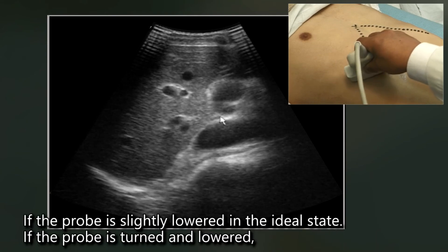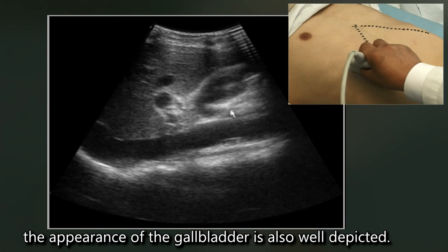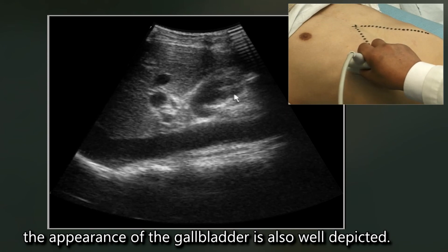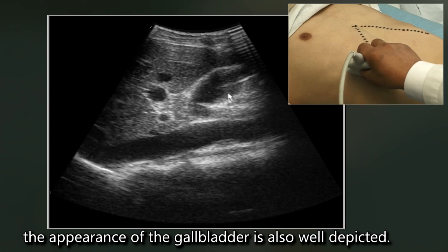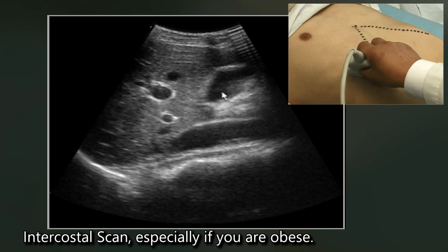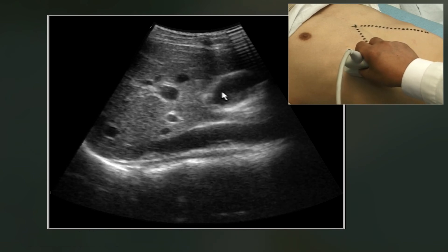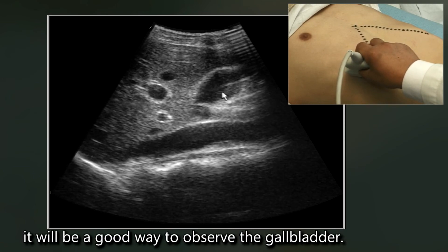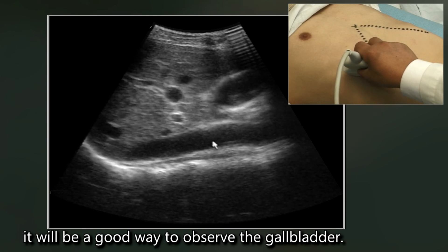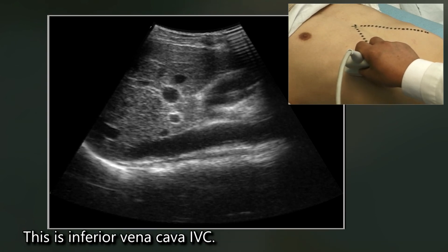If the probe is slightly lowered and turned in the ideal state, the appearance of the gallbladder is also well depicted. This intercostal scan is especially useful for obese patients as a good way to observe the gallbladder. Also visible here is the inferior vena cava (IVC).